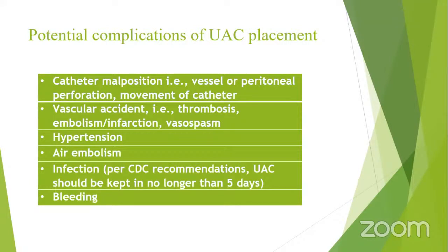Hypertension, air embolism, infection. Per CDC recommendations, UAC should be kept in no longer than 5 days. And bleeding.